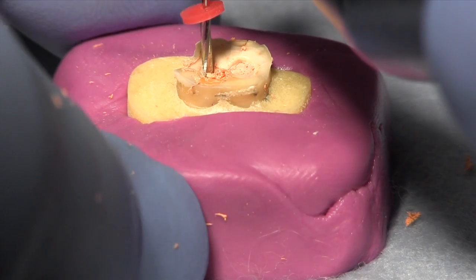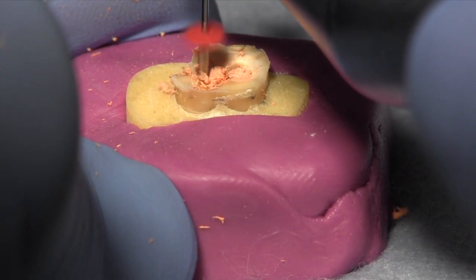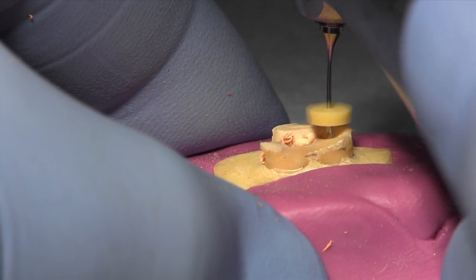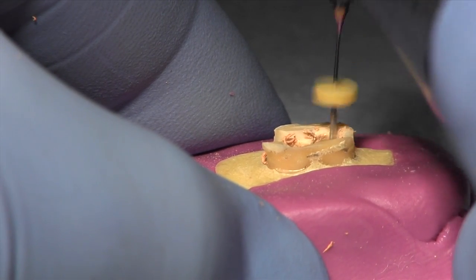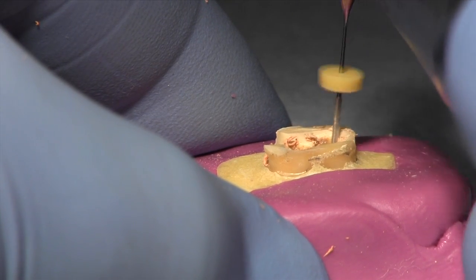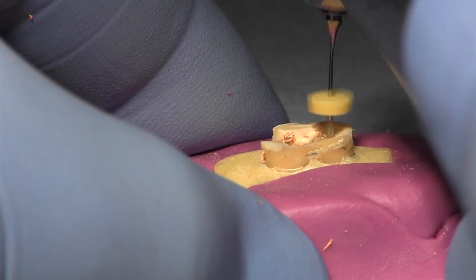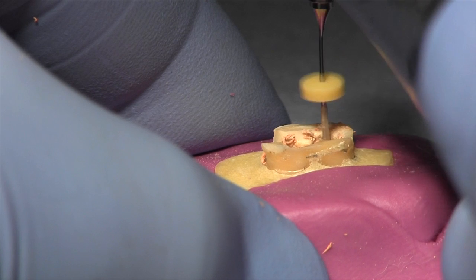After making a hole in the filling material, the side flutes of your instrument should engage the gutta percha and actually pull you down the canal — no pressure is necessary. Use a stopper on your drill to make sure you don't over-prepare the canal, and leave at least five millimeters at the apex of the root. Once you've reached your working length, use a slight side-to-side motion as you move your instrument up and down the canal walls to remove any remaining gutta percha.